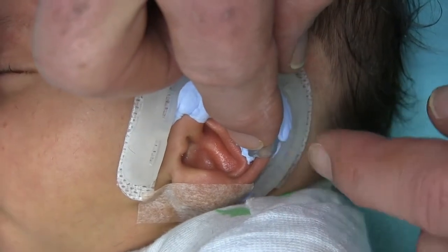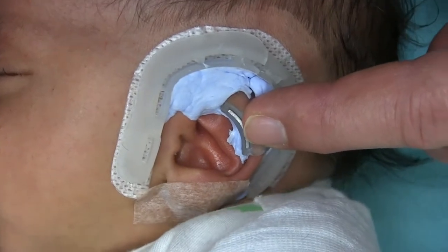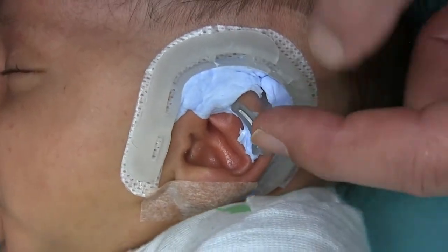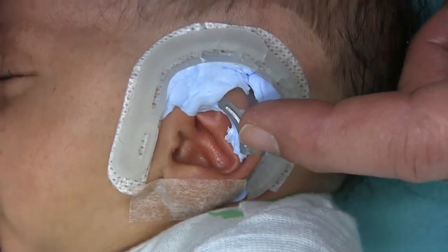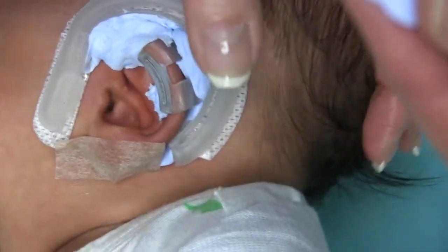I can get the retractor locked in as good on this side as I did on the other. Yeah, it's got a good imprint. But that stuff didn't— it's set up. It didn't set up quite right. Yeah, looks good though.